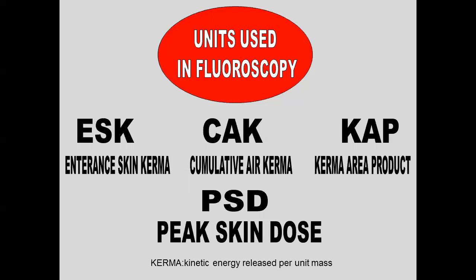So if you're looking for radiation burns, if you move 20 degrees, you're going to another entirely different patch of skin. So your chances of skin burn gets lower as you do different parts. Now, if any of those overlap, then you have to take in that one strip of skin may have gotten a lot of radiation.